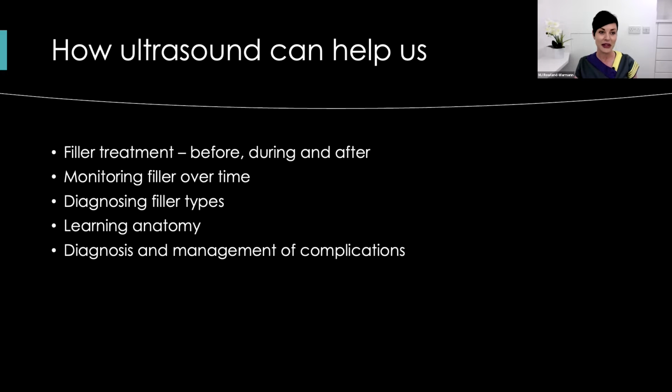Using it in filler treatment is a godsend, whether that be before treatment to vascular map, during treatment to place filler using ultrasound guidance, or after treatment to confirm placement. It is key to predictable outcomes. We can check up on our filler over time, decide what's hidden in our patients' faces if we come across historic filler, and we can learn a huge amount of anatomy using it in our daily practice.